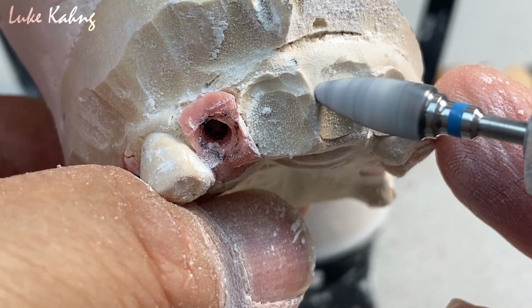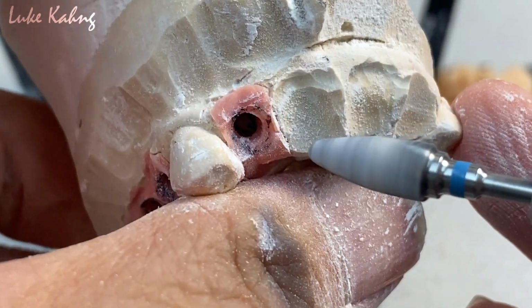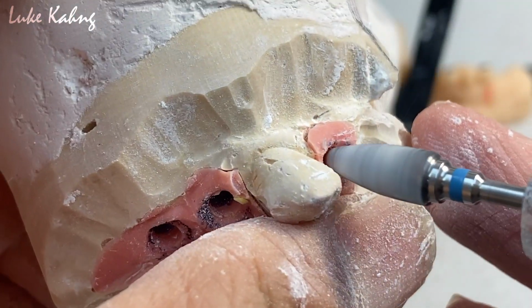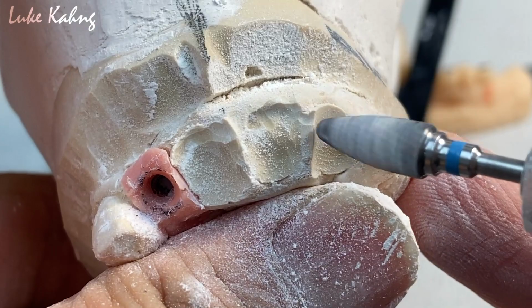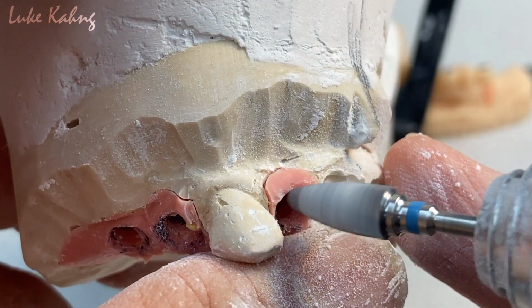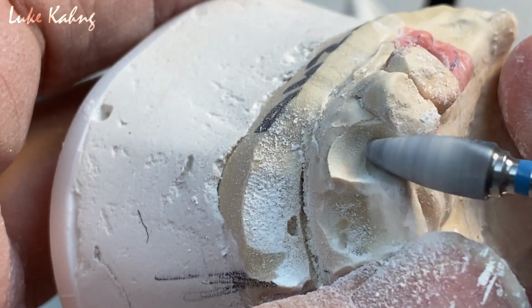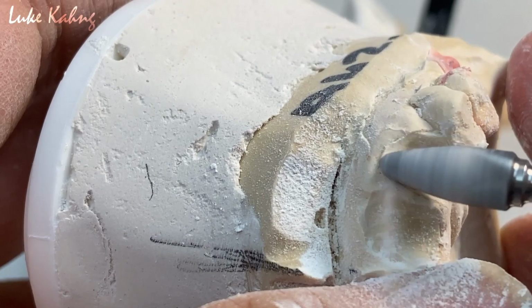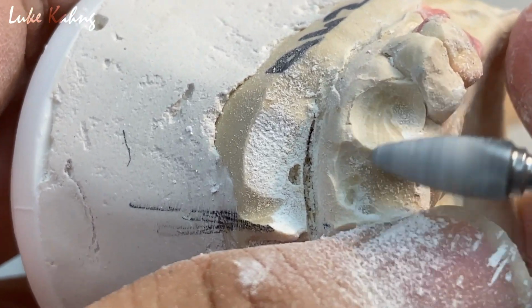Okay. So this is the central. Remember, as I said, I'm going to grind the disc just like here more, okay? Because look at this on the other side, the tissue contour, just like you pay the same as the other side, which is all about the symmetry from here. And if you did not do this, it will be a different shape and contour.